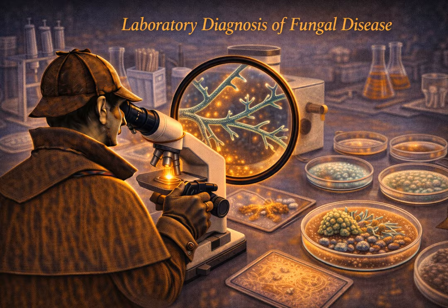Yeah. Okay, so we have the media sorted. Now, the incubation conditions. Temperature matters in the fungal world a lot more than I initially realized. It's a key variable. We generally use two temperature settings in the incubators. Yeah. 25 to 30 degrees Celsius. That's essentially room temperature, or slightly above. And 35 to 37 degrees Celsius. That's human body temperature. And this brings us to what I think is the coolest biological trick in the kingdom, the dimorphic fungi, the shapeshifters.